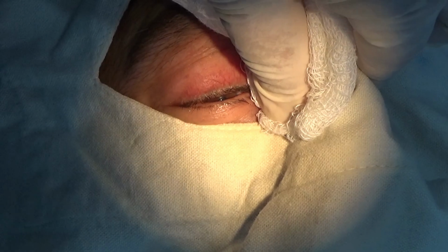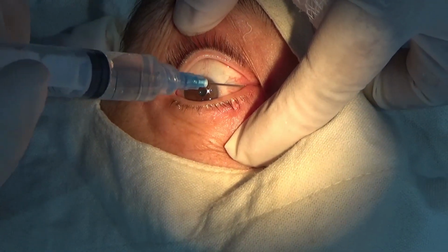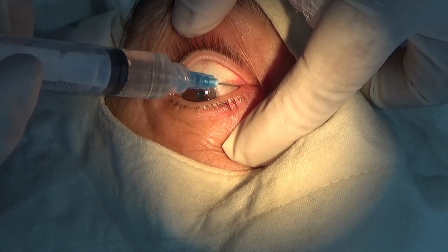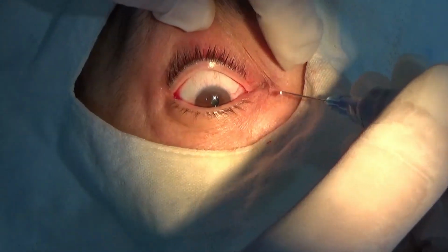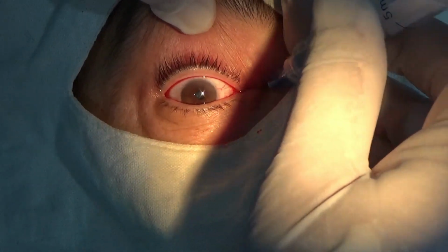I also inject about half cc local anesthetic medially through the medial canthus in front of caruncle. Moreover, about 1 cc of local anesthetic is injected deep into the lacrimal sac area.